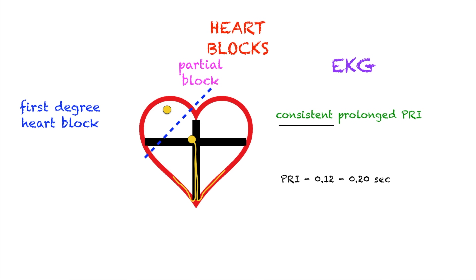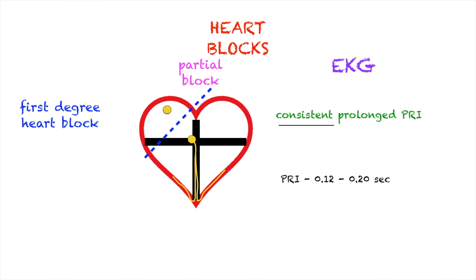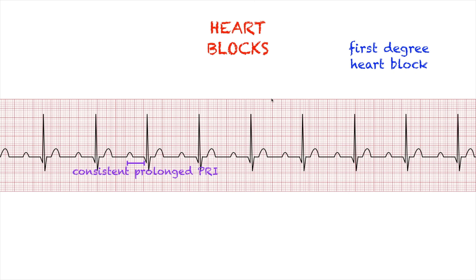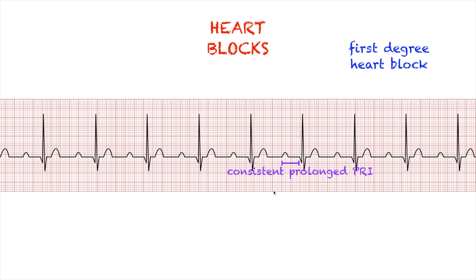Our normal PR interval is between 0.12 to 0.20 seconds. So first degree heart block will look something like this. Sometimes just by looking at your PRI you can tell it is prolonged, but the best way to know is when you measure it. For this EKG strip, there are 9 small boxes times 0.04 seconds. Your PRI for this EKG strip is 0.36 seconds — that is pretty long. Our normal is only up to 0.20 seconds. If you measure your other PRIs, they are consistently long — the same measurements. That is your first degree heart block: consistently prolonged PRI.